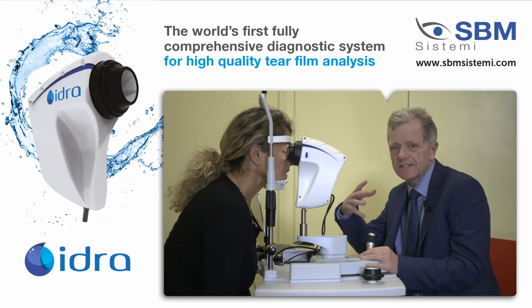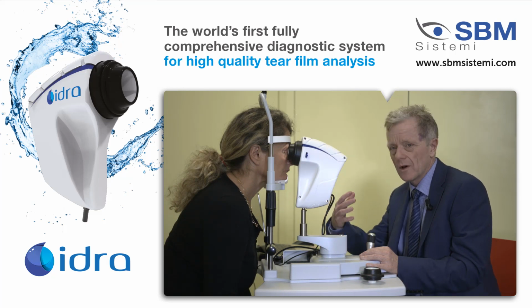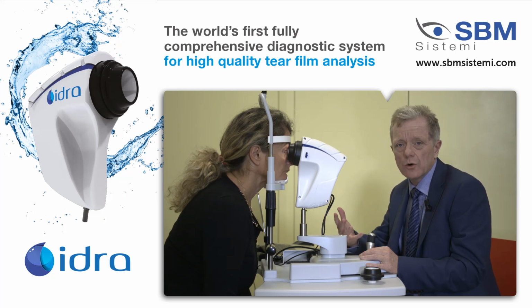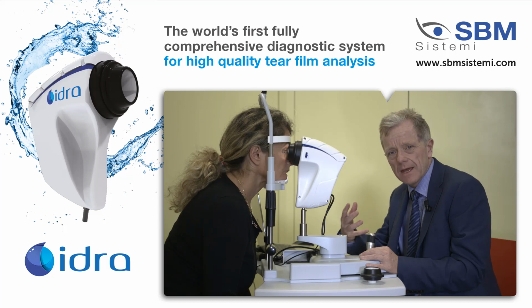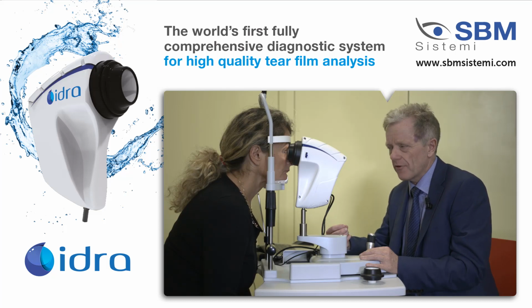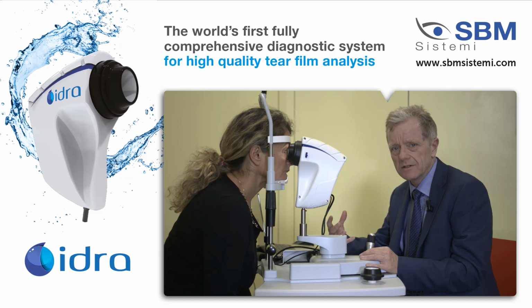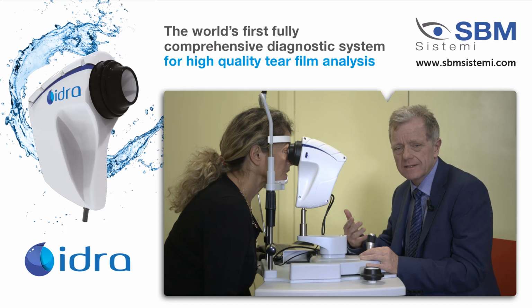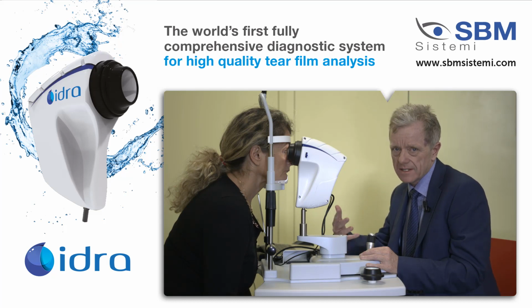So we can see this is a no-touch procedure. It's something that, whilst I'm using the technology here, the clinician can use the technology, or even a nurse or a front of office staff. Being a no-touch procedure, it is simple, straightforward, and easy for a non-qualified person to actually undertake these tests. This is the advantage for me because it releases my time to see patients in a clinical environment.